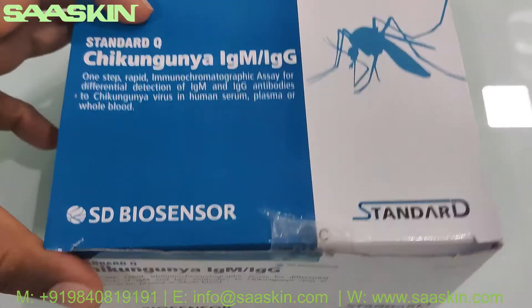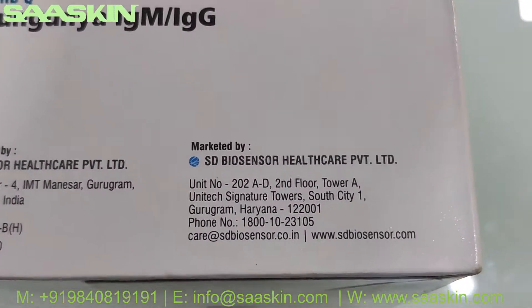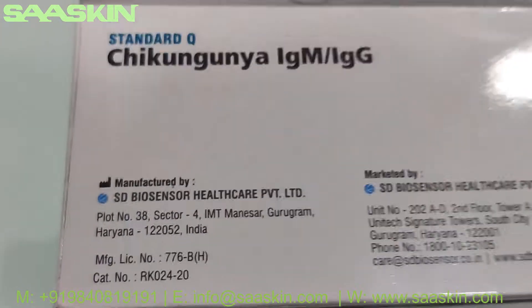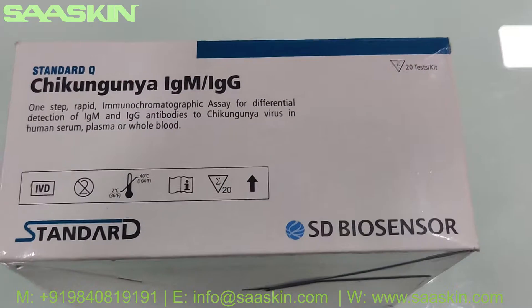Let me show you around. This is manufactured by the SD Biosensor Indian plant. This is how the box looks like.